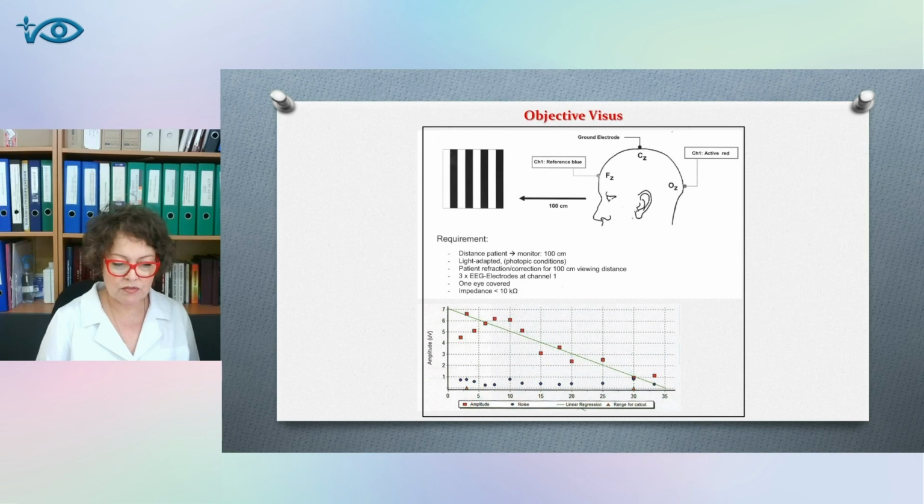There is a correlation between visual acuity and the size of the checkerboard square of the reversal pattern. Thus, when visual acuity is not less than 0.3, the VEP pattern is registered per cell of 10 minutes. At visual acuity 0.2, per cell 20 minutes. At visual acuity 0.1, per cell 40 minutes. This confirms the preservation of the function of neurons that conduct and perceive a signal of a certain spatial frequency. This principle was used when creating the objective Visus program.